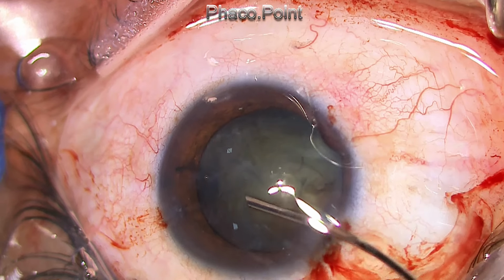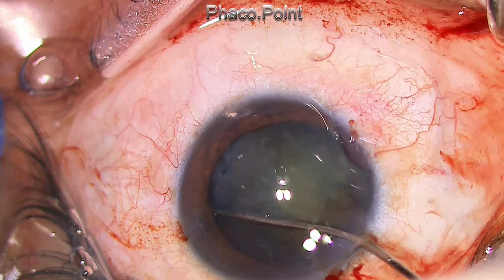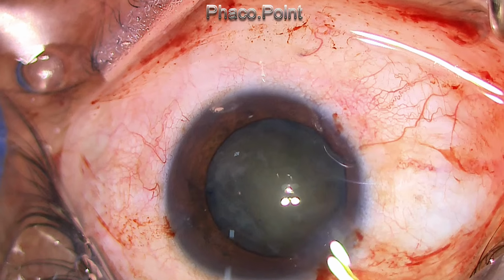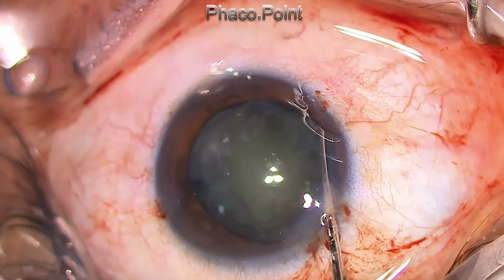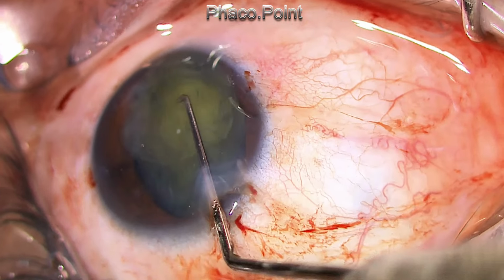And see what happens when I do the cortical cleavage hydrodissection. As I do the hydrodissection, one of the poles of the nucleus pops up and presents itself. And then I use this to my advantage. I wheel the entire soft lens out of the capsular bag. Even though it was a similar case, the way the case progressed was slightly different.